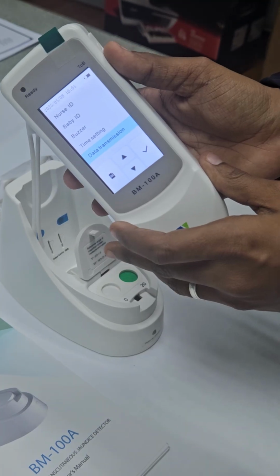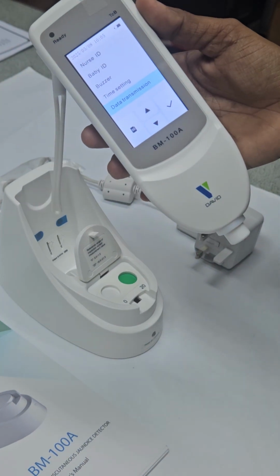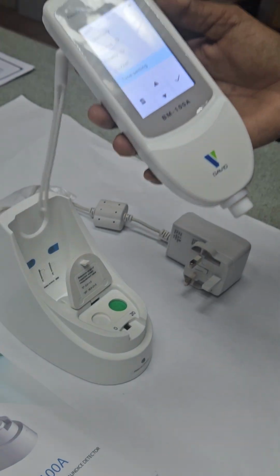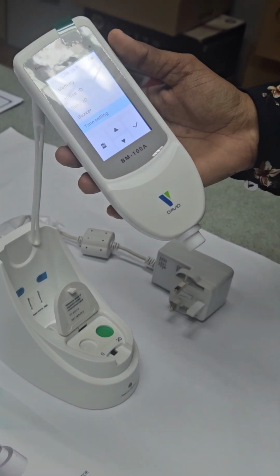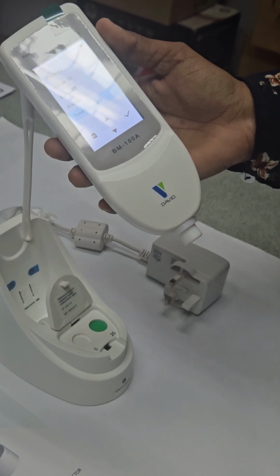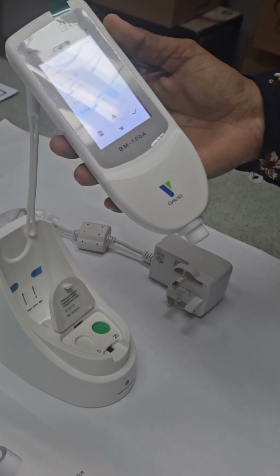What's the normal range? 3. Oh, 3 average. Yeah, average 3. Most of our users choose to go for average 3 times. What is the reading supposed to be, low or high? Because sometimes I think the nurse cannot remember what the number is.